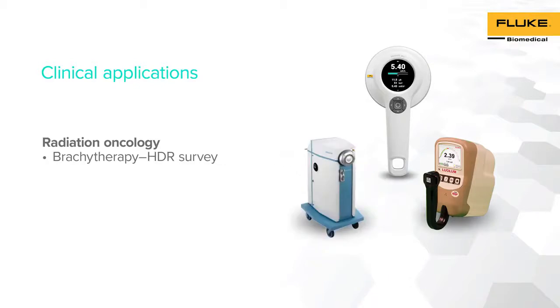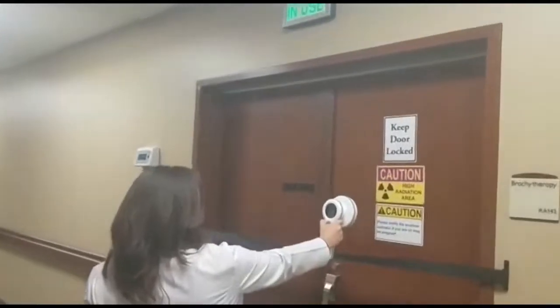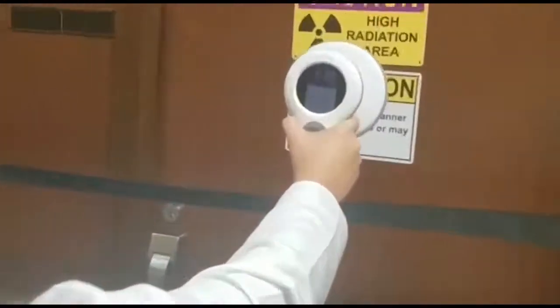We will now demonstrate how the RACE-A 452 survey meter can be used for brachytherapy applications by performing a room survey in an Iridium-192 source survey. HDR rooms and barriers can be surveyed to collect exposure measurements.